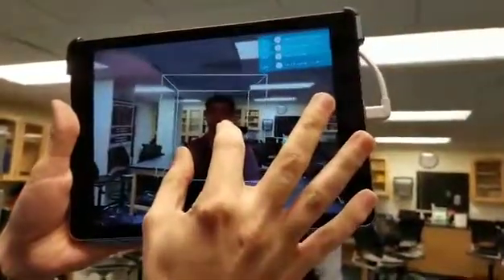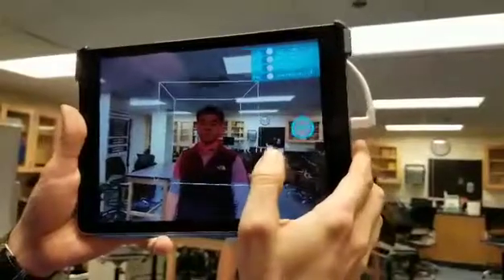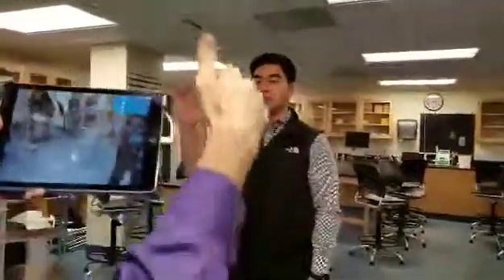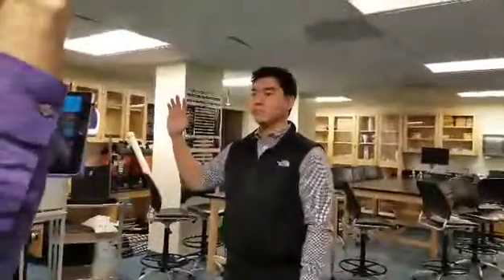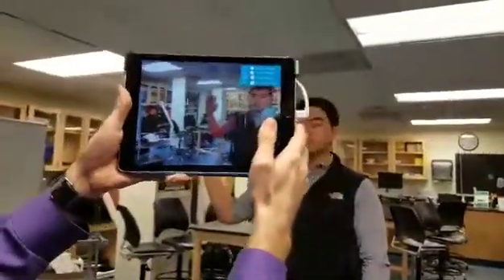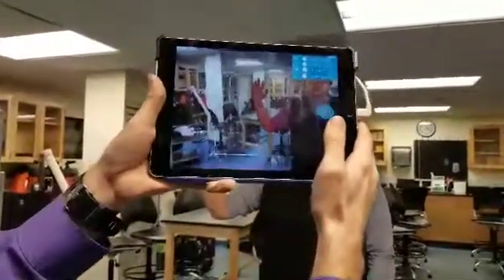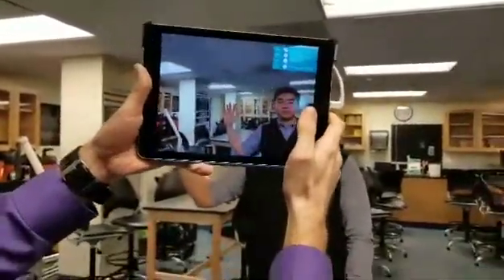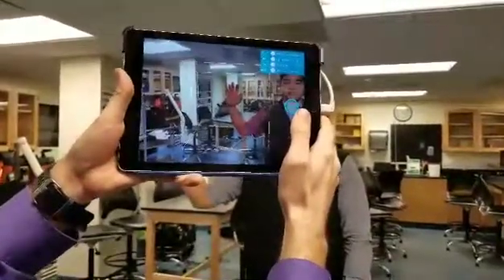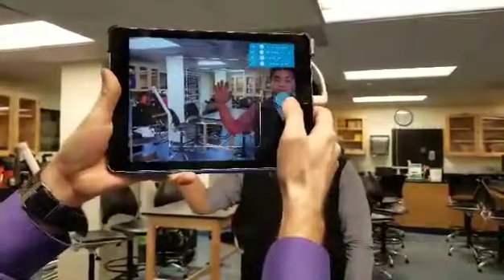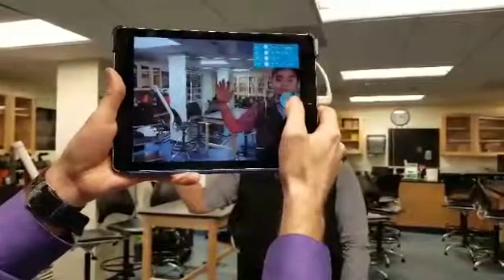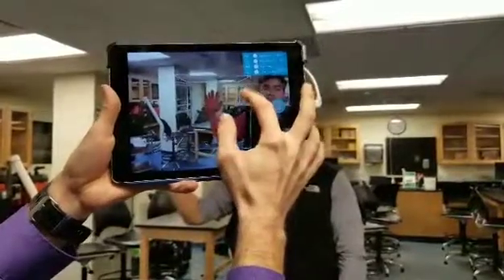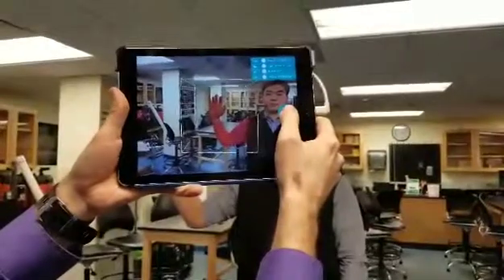Most people watching this tutorial will actually want to get the arm, not the face. I find the best way to get an arm scan is to have the recipient hold their arm out from their body and hold it up, exactly like Philip is doing. We're going to try to get a good view of his hand. It can be tricky to get the angle just right — if you're a little bit off it won't work. As long as you're level with the thing you're trying to scan, get a nice steady hand, and hit scan, you'll see that all the colored area starts turning white. Try to limit the box to be as small as you can so you don't get any extraneous features.